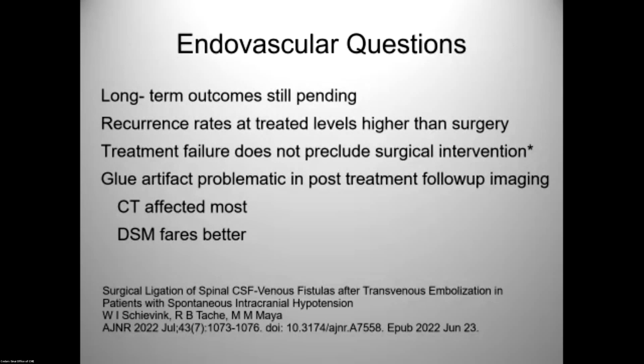What are some lingering questions about the endovascular approach? Well, the long-term outcomes are still pending. After that paper, I had some communication that Dr. Brinjikji is preparing a longer follow-up paper with a larger number of patients, and I'm looking forward to that. I think the recurrence rates at treated levels are higher than surgery, as our experience, and so it's not quite close to the surgical treatment success rate, but it's high up there.